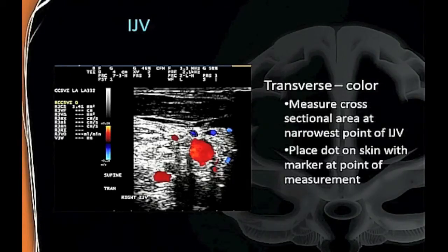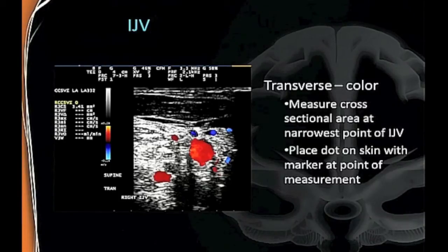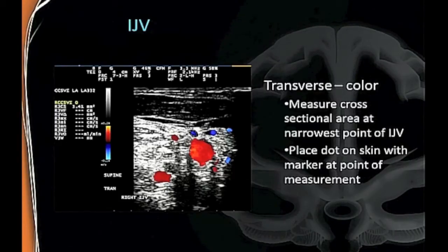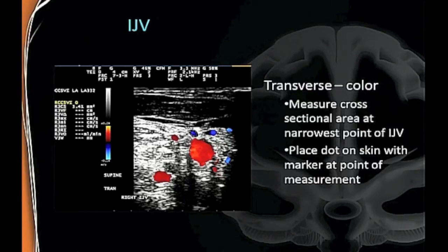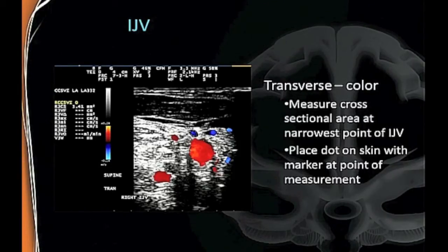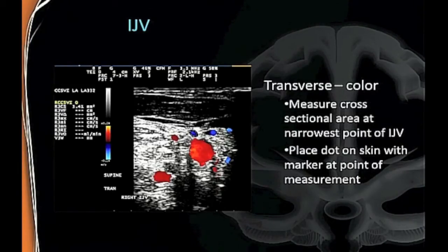Now we're going to measure your CSA. When you pan through in color, you notice the narrowest point. We measure it in color flow—not just the lumen alone, and I'll explain why shortly. Here is the jugular, and we're measuring 3.41 cm² in supine position. When you take this measurement in transverse, you mark it on the skin so you can re-measure at that exact location when you turn the patient upright.